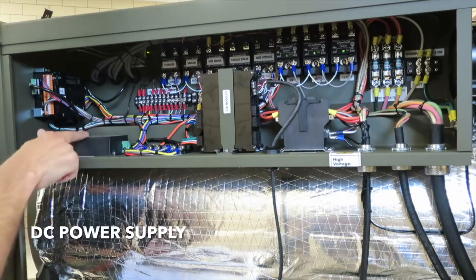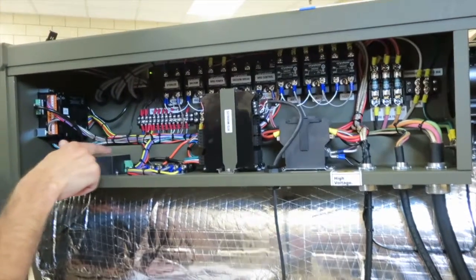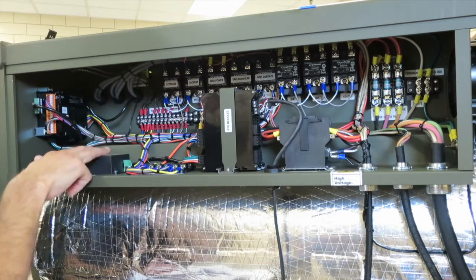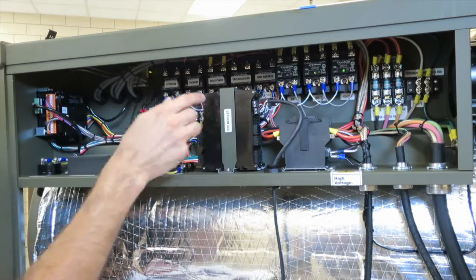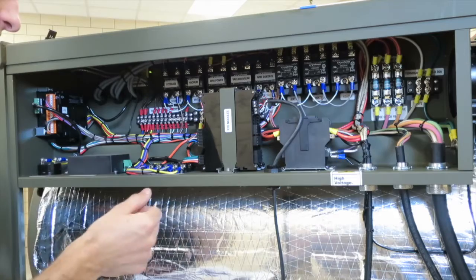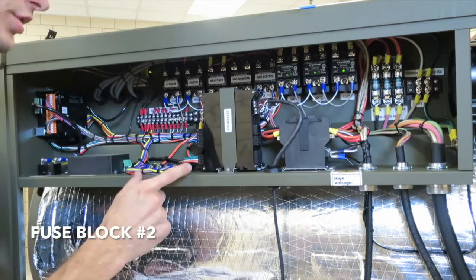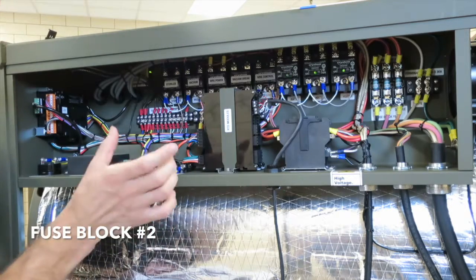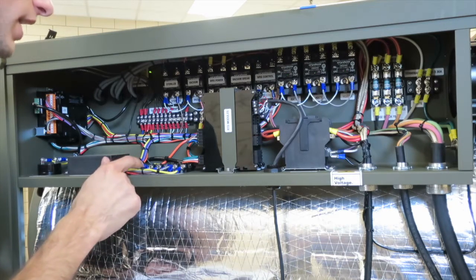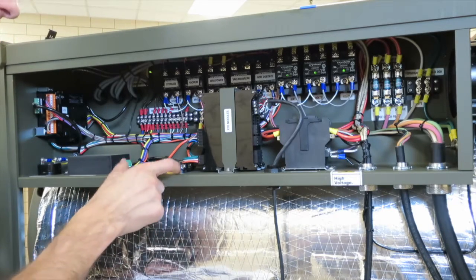Right here we have the DC power supply. On the left we have 120 volts coming in, and on the right we have 24 volts coming out. This power supply is what supplies power to the PLC, to the transmitters. Anything that needs 24 volts is coming from this power supply. Right here we have fuse block number 2. These all use the same fuse. It's a replacement part in your manual. These first 2 right here are 120 volts and the rest are 24 volts. So that's fuse block number 2.